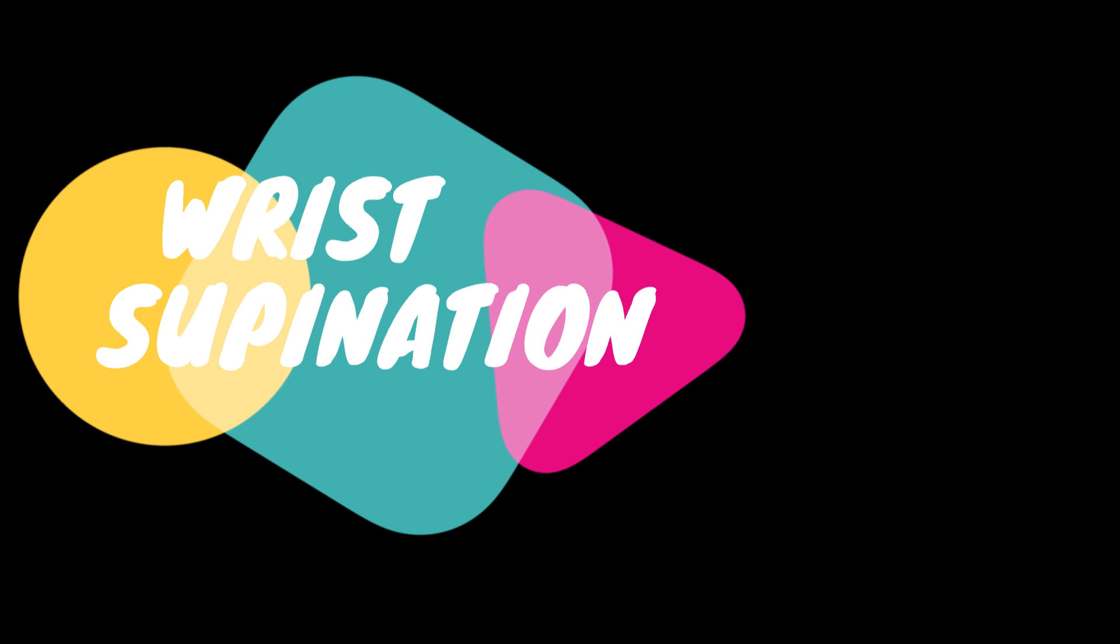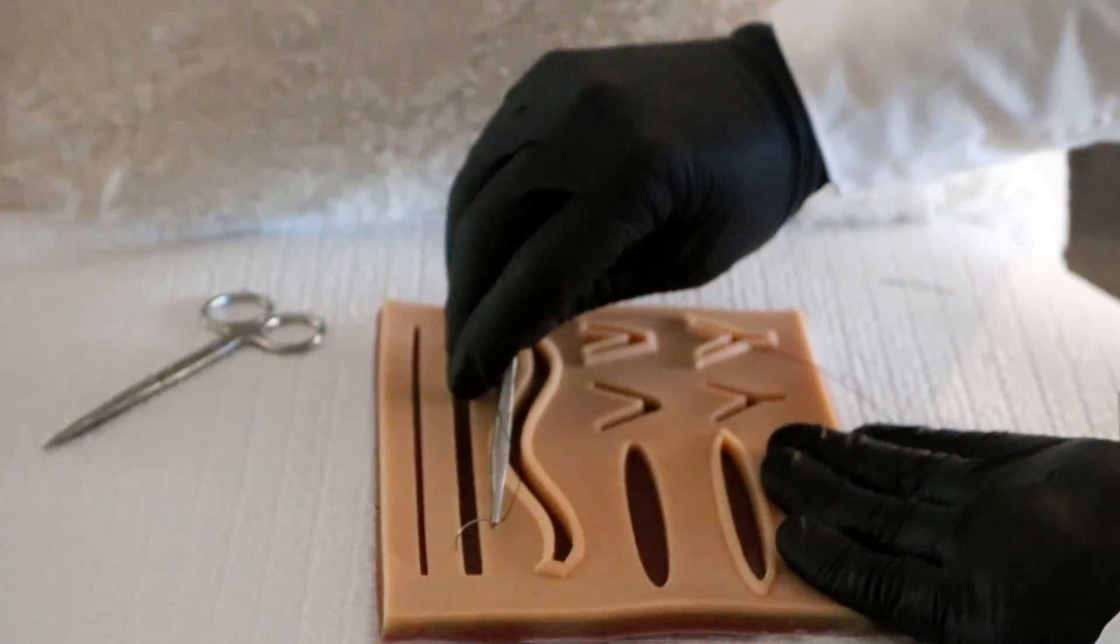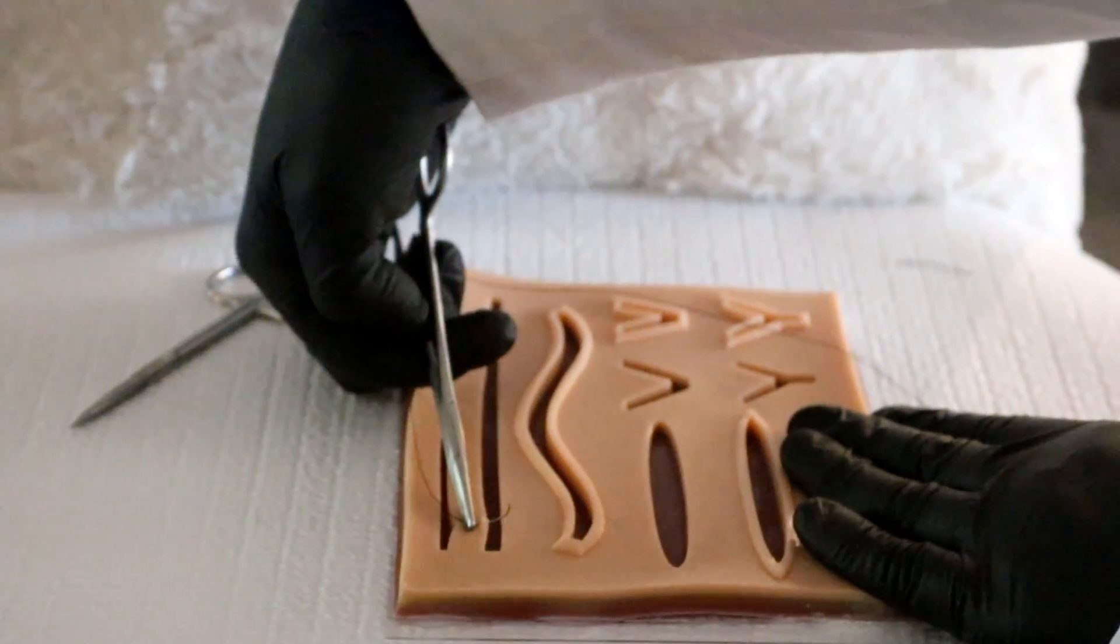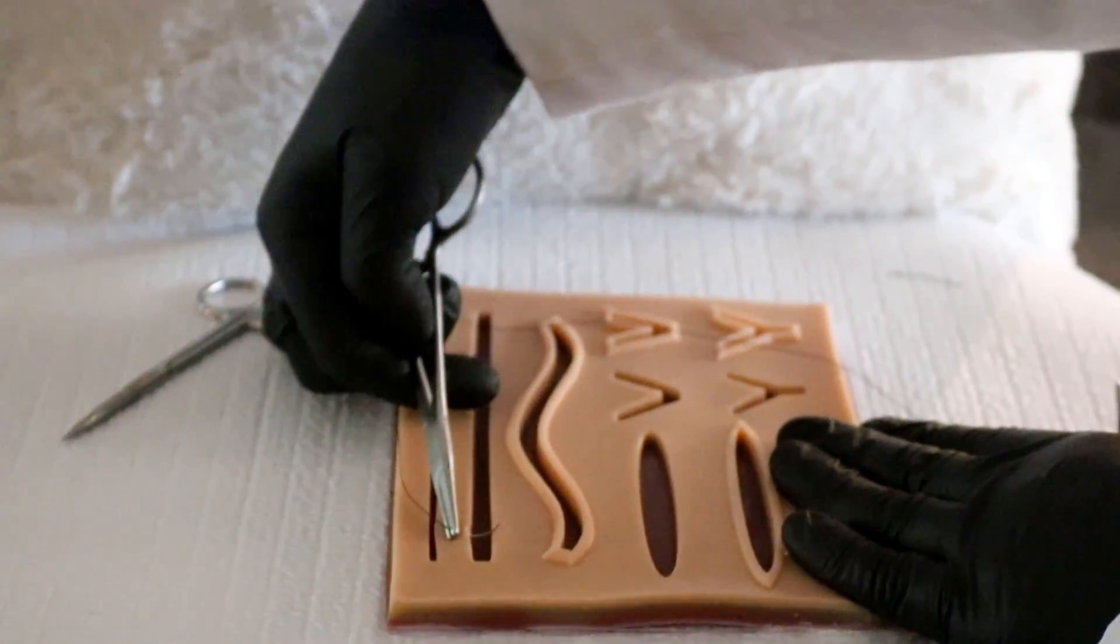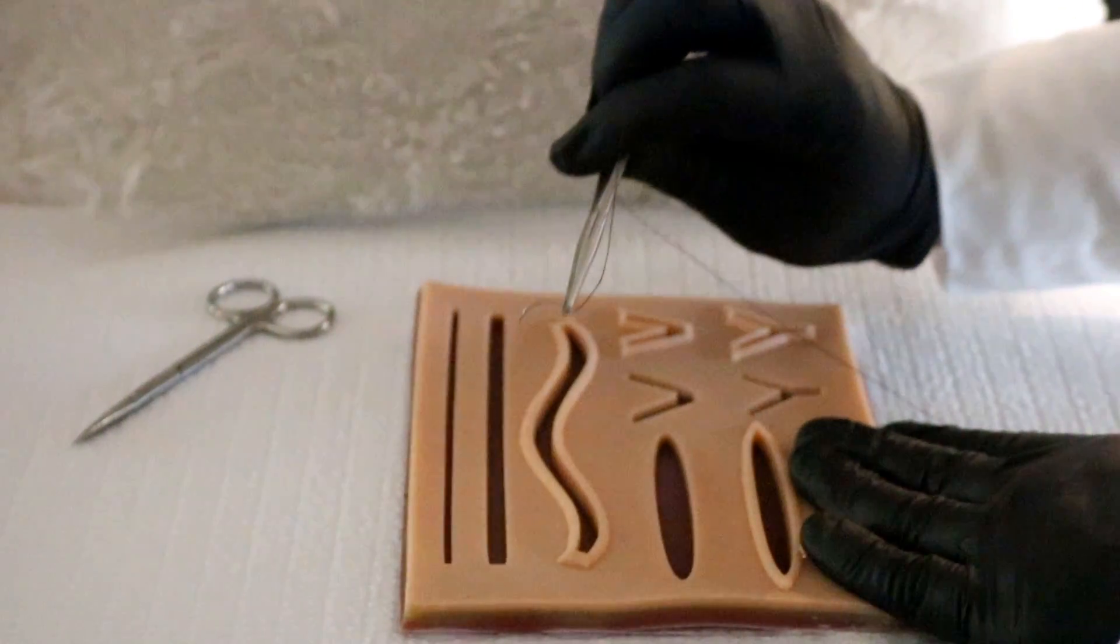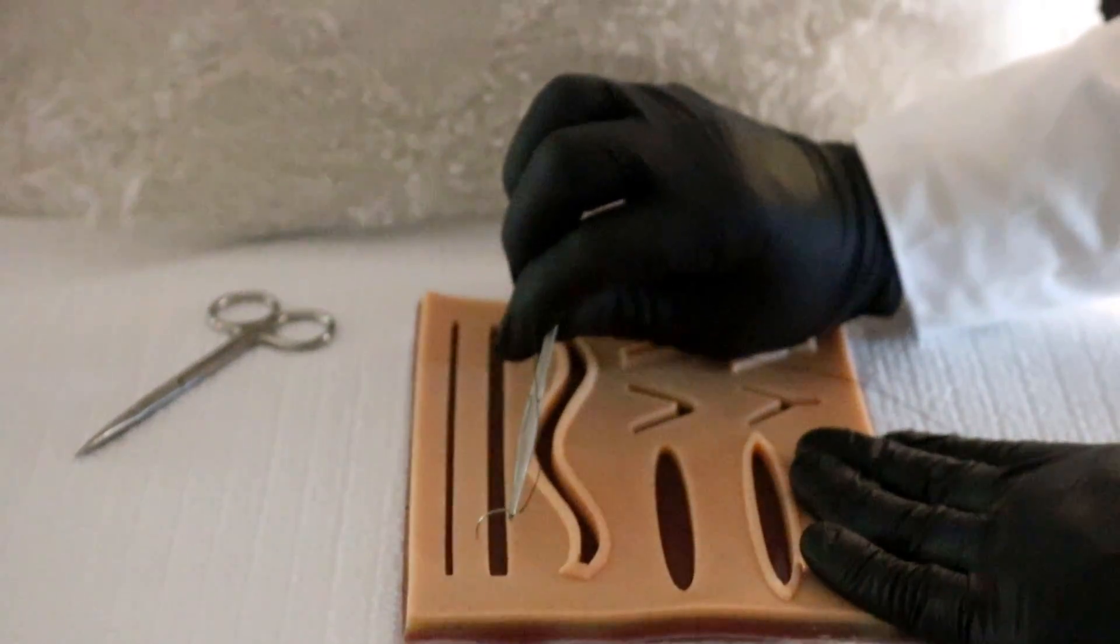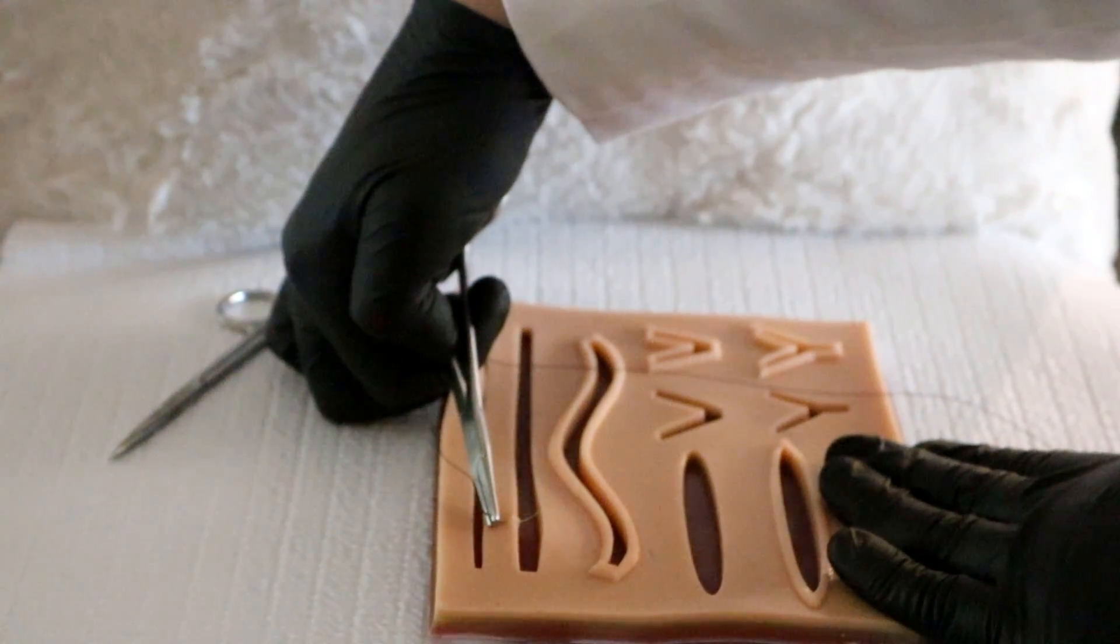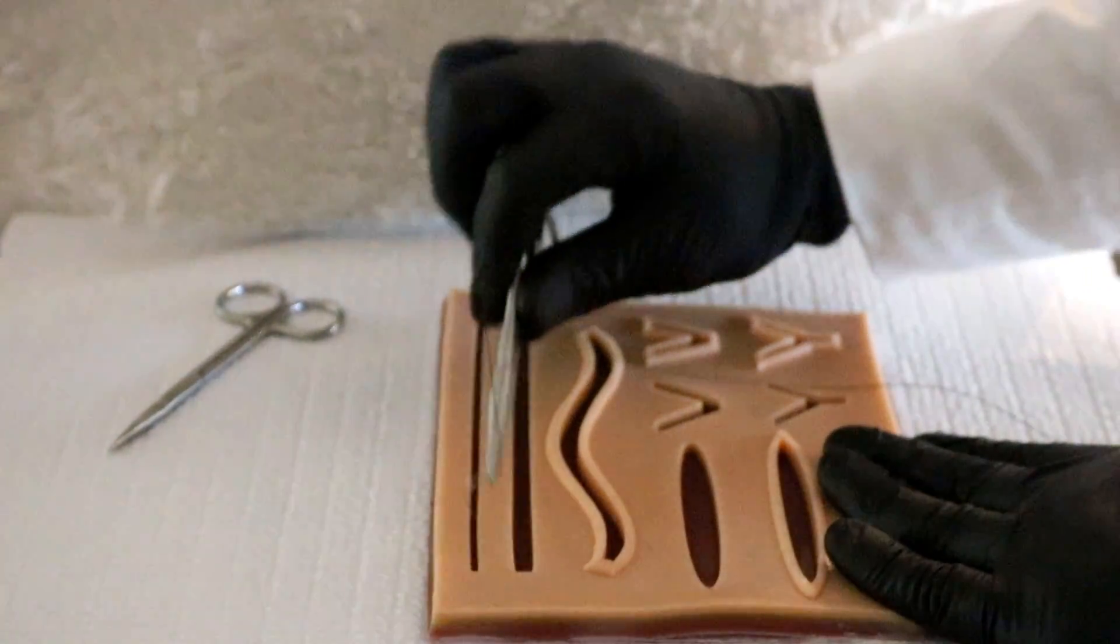So let's go right into wrist supination. With the wrist supination this is very important. So needle tip again perpendicular and then you see my wrist supinating right there. Alright and once again.